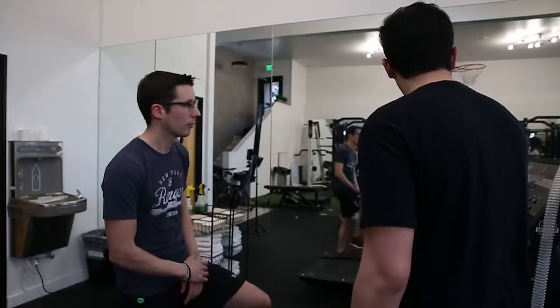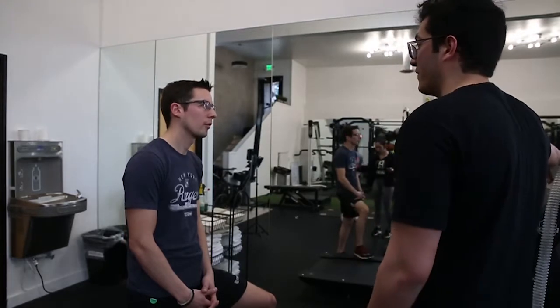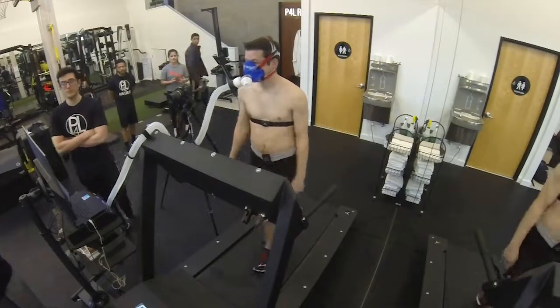So I'll have you on the treadmill at 15% incline, so you can be going uphill, okay? At a 1.7 speed, so pretty slow at first, okay? The first 2 rounds are only gonna be a minute long. Every round, I increase it by 0.8 miles an hour, okay?